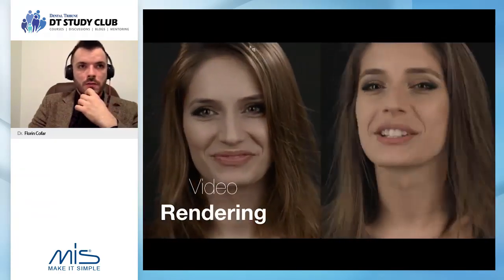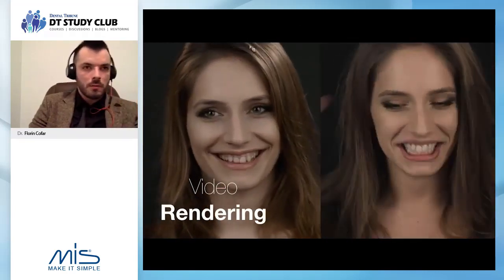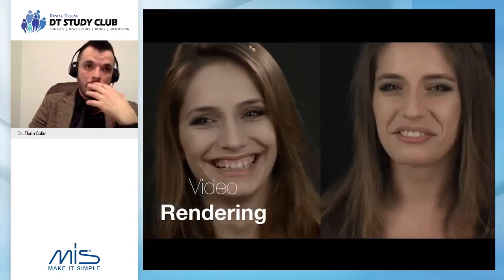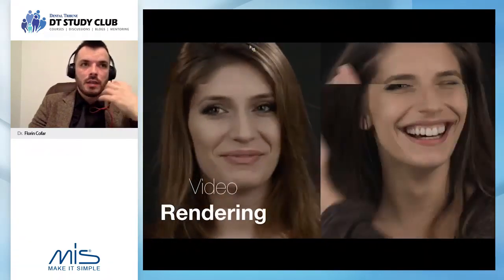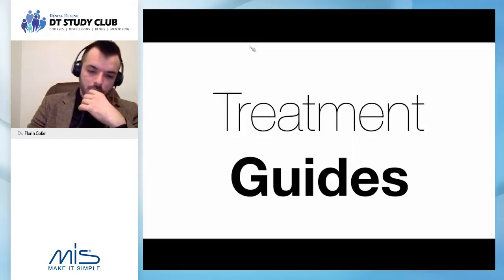Also, if you show in a video, the patient understands that it is a rendering and not the final. Whereas if you show a mock-up in any way, using, I don't know, showing with the mirror or any other way, the patient tends to think that the mock-up is the same as the final. You can see this by the question they ask.